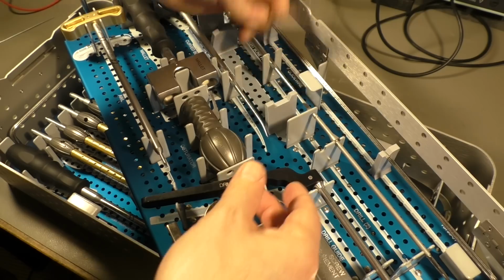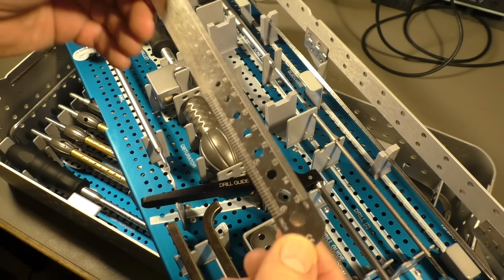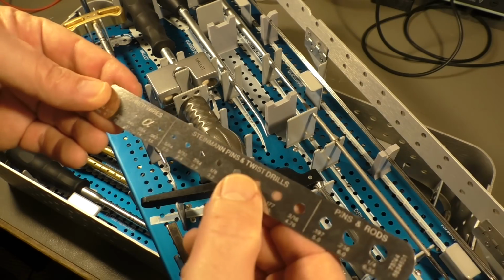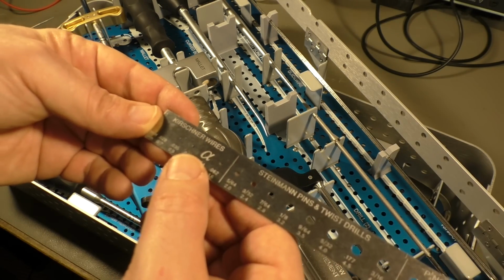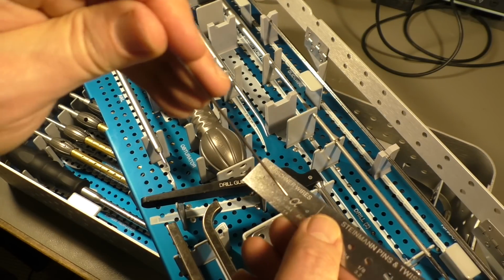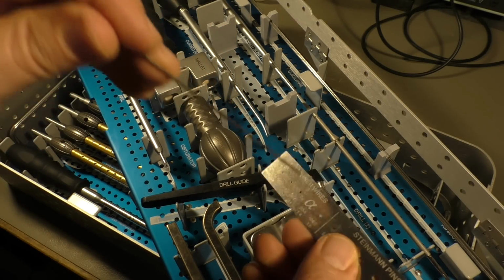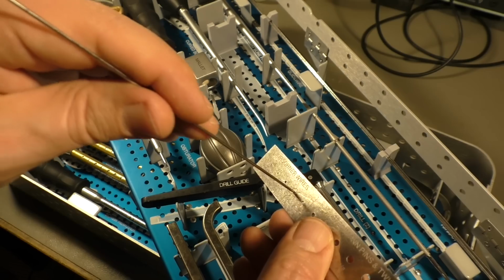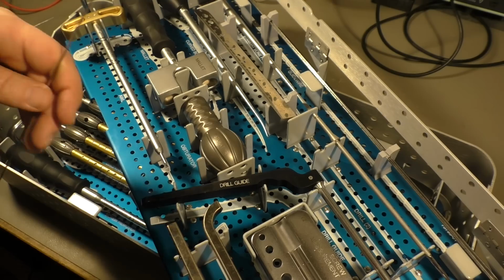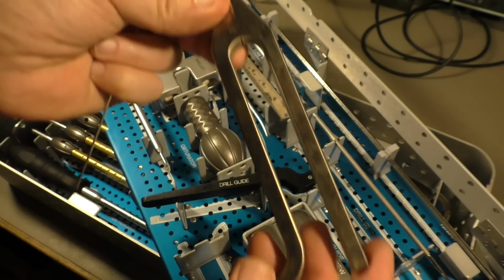Okay, there is a small ruler with some holes for measuring drill size. Yes, that's written here: twist drills, Kirschner wires. We also have some wires here. Let's see what diameter they have. Yes, I think it's that one. That would be a 1.4 millimeter wire. Okay, measuring tools.